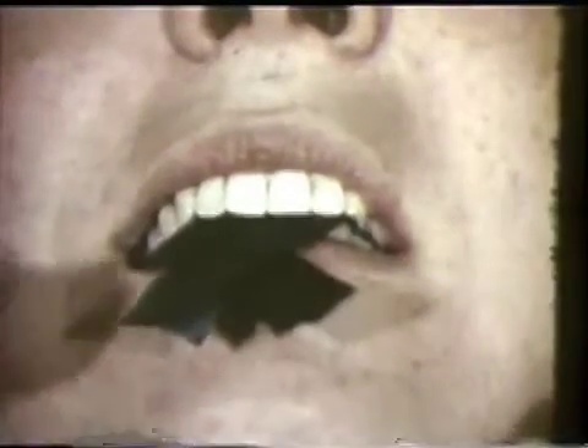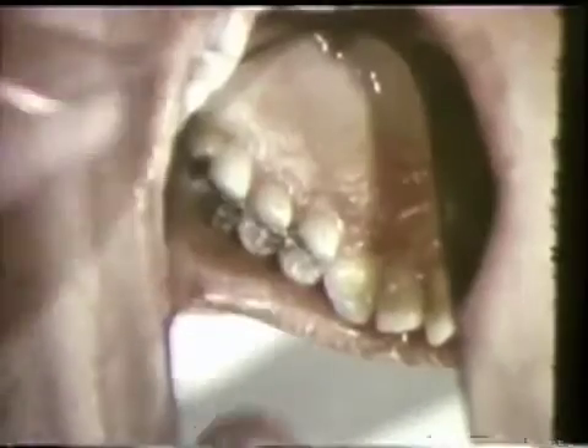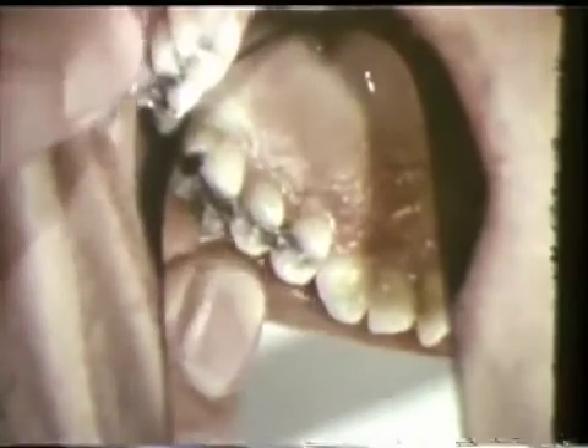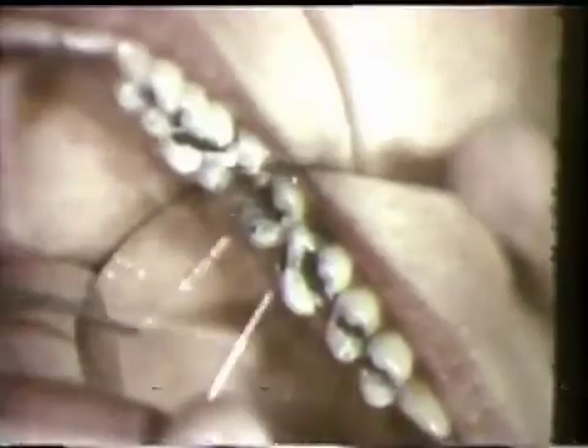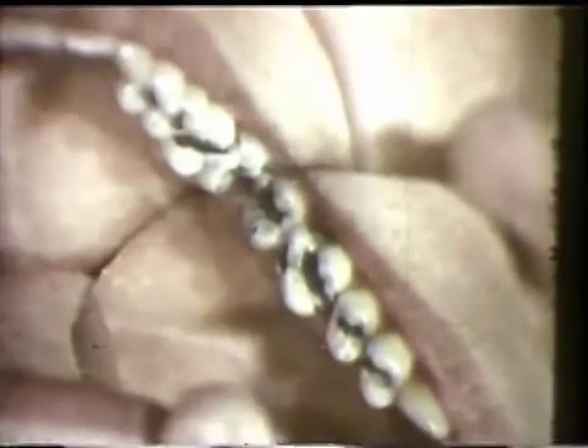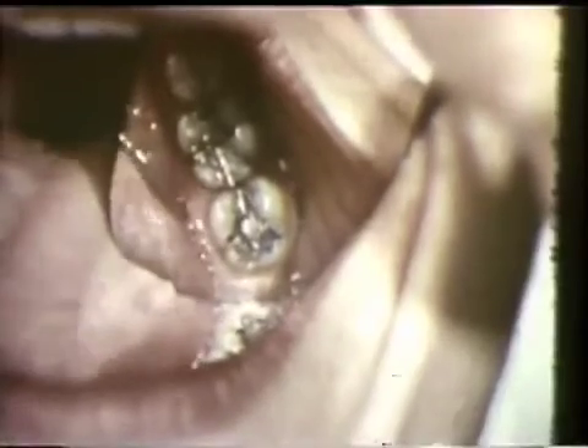With carbon paper between the teeth on both sides, the patient is asked to repeat the movement. The marks of initial contact are on the cuspid on the working side and the buccal incline of the lingual cusp of the maxillary left second molar on the balancing side. In the mandible, the balancing contact is against the mesiolingual incline of the distobuccal cusp of the mandibular second molar.